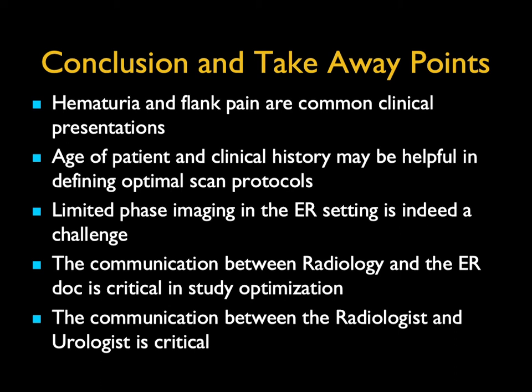Limited phase imaging in the ER setting is a challenge, so again, comparisons can be helpful. Good injection rate and thin sections and reconstructions become critical to me. In the ER, we often have limited phases, which can be challenging. It's important to have good communication between the radiologist and the ER doc and potentially the urologist. And the communication between everyone is indeed critical.